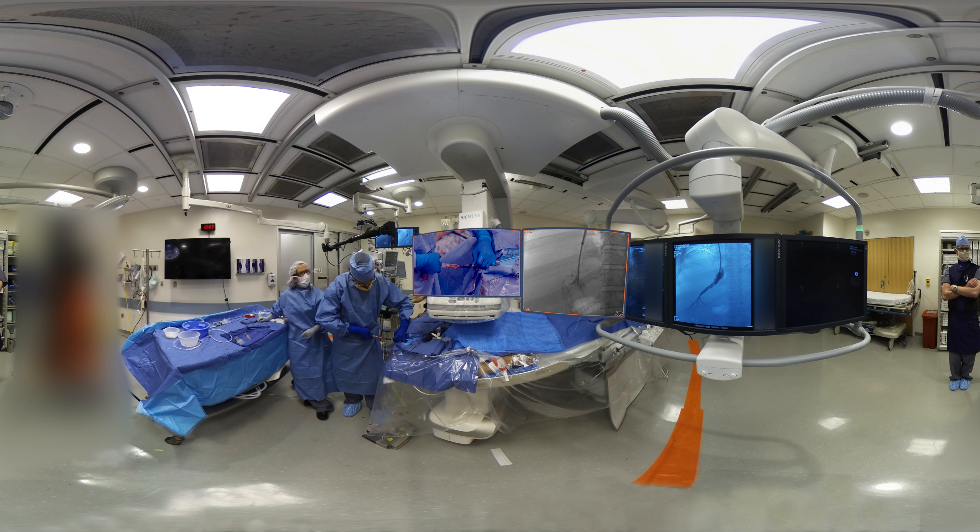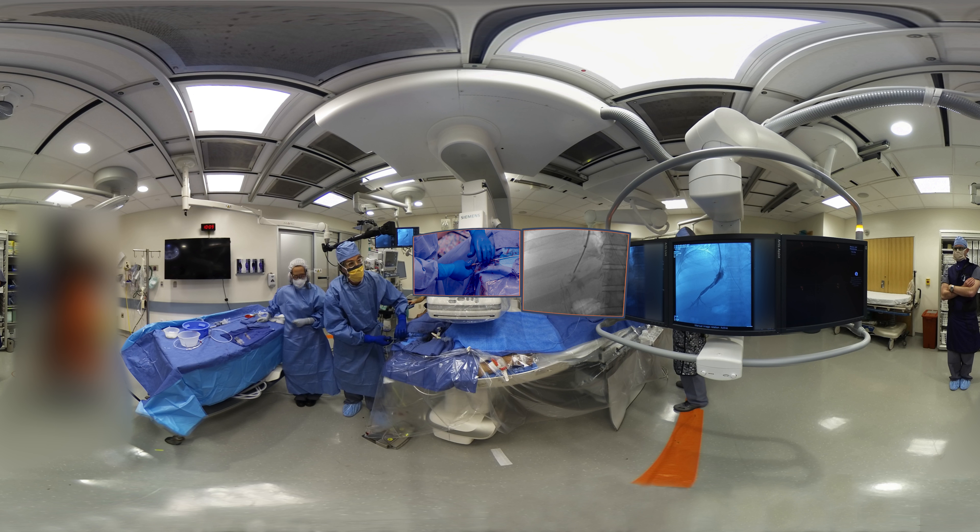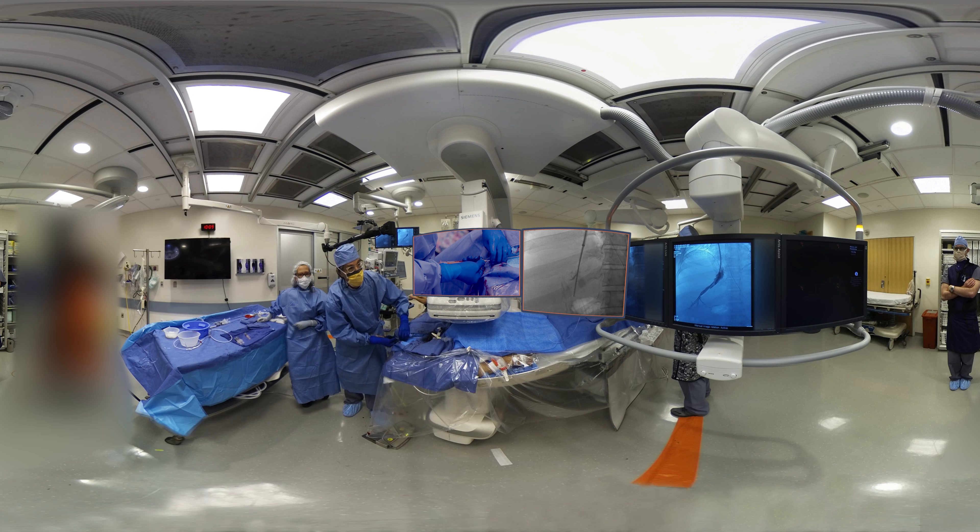I'm typically looking for some clue to portal vein entry, or at least a portal vein branch, within a few punctures. It's bubbling a little bit and while there isn't return, that's often a clue that we're about to enter something or are near. In this case, we're getting the early clue to the hepatic vein — so that's hepatic vein filling, but sometimes the portal vein is nearby. So what we're going to do is not fall into the hepatic vein and have to reposition, but in fact rotate the needle once again and then advance, redirecting a little bit within the tract.